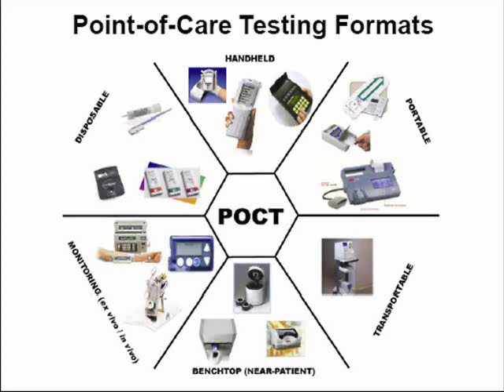Next, we have monitoring devices. These are very interesting devices which plug into an indwelling catheter, so a line that's connected into the circulatory system of the patient. It provides real-time monitoring of electrolytes, for example, in blood gases. They are commonly used in neonates and pediatric patients, as shown in the device in the bottom.